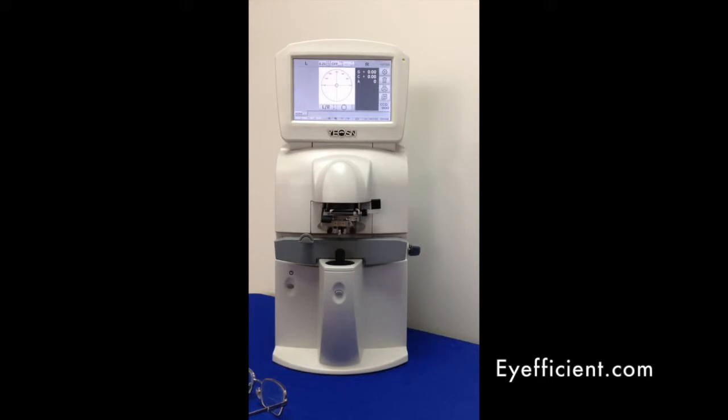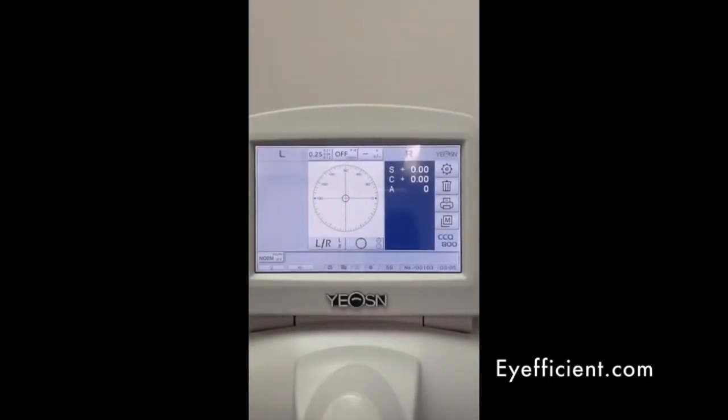Now I want to show you a little bit about the software briefly. Looking at the software screen, you're going to see it's organized very nicely — it's basically a what-you-see-is-what-you-get GUI interface. Your left eye readings are going to be here, and your right eye readings are going to be here.